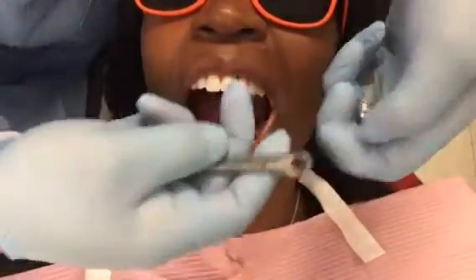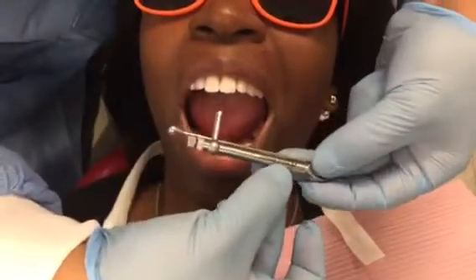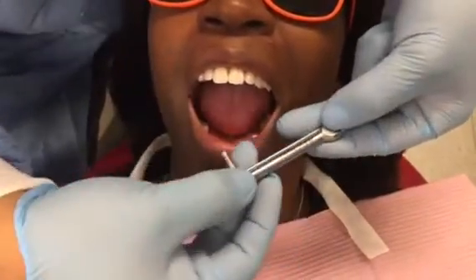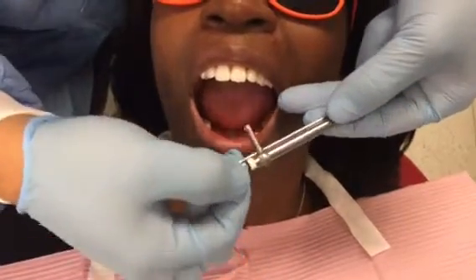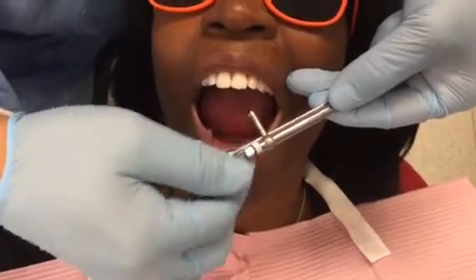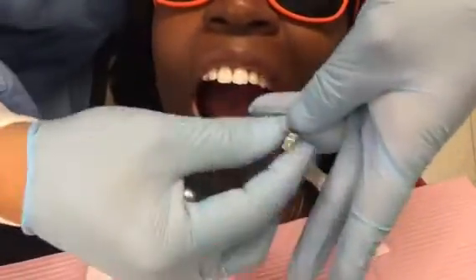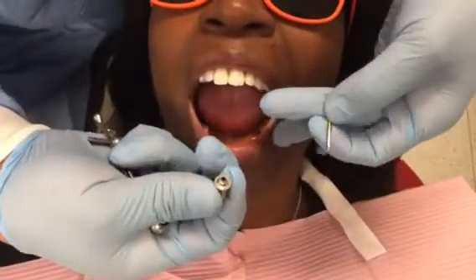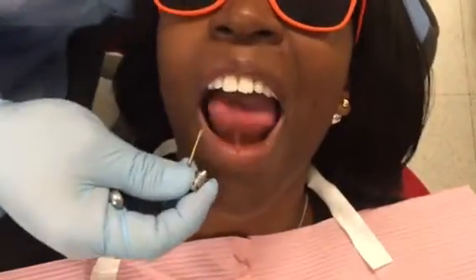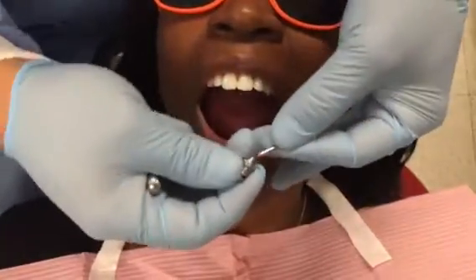So what we need here is the torque wrench. The torque wrench has two sides — the side that has the script and the other side that doesn't have anything. You want this side. If you see this arrow, the little arrow right here, you can turn it back and forward. I want the arrow towards this part of the torque wrench. So this part comes in two pieces — it depends upon what kind of crown you're looking at, you might need the big or the small. We're going to use the big here.